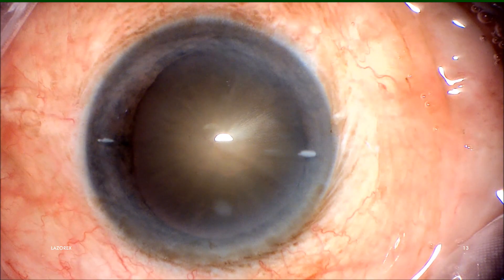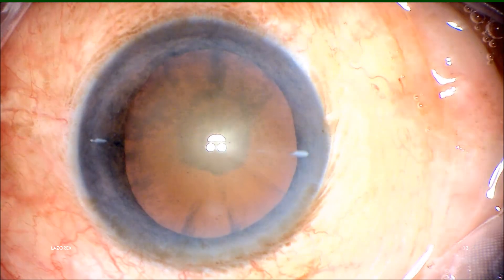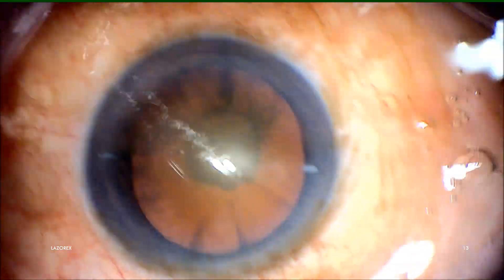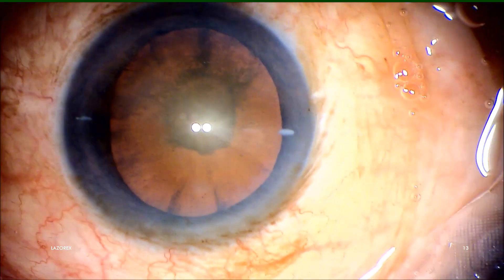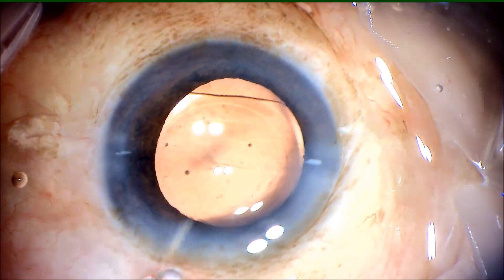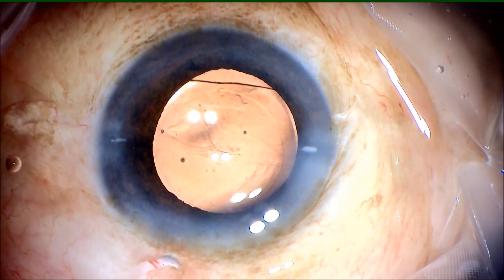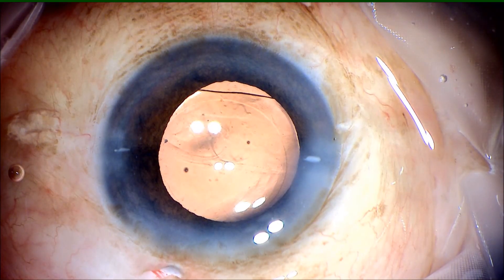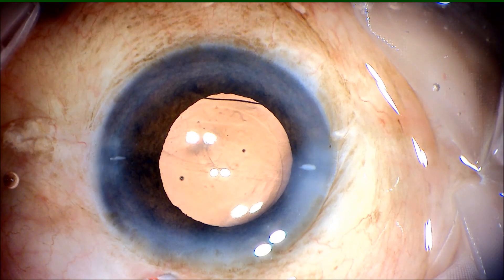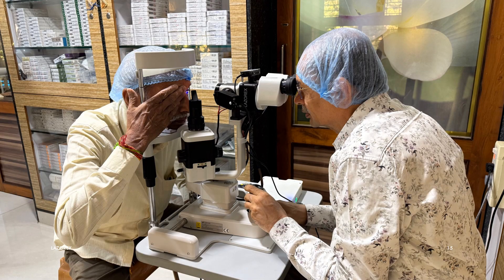This is how LaserX marks look on the table. The marks remain as-is throughout the surgery and they stay afterwards for many hours — LaserX marks stay for about 12 hours. So we can do the marking in advance a few hours before, or just a few minutes before the surgery.